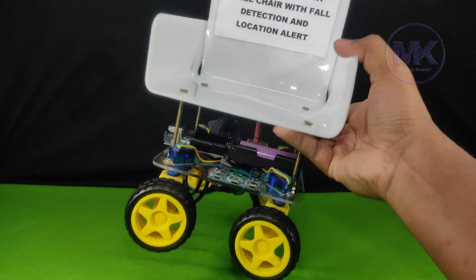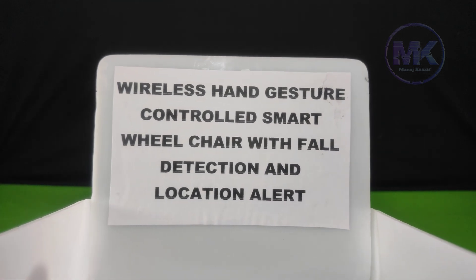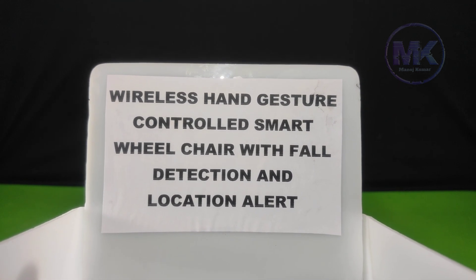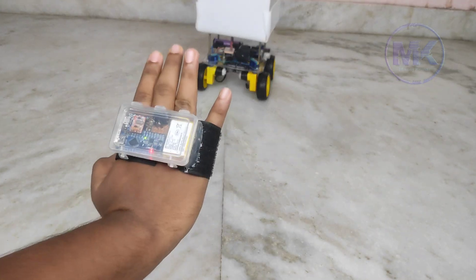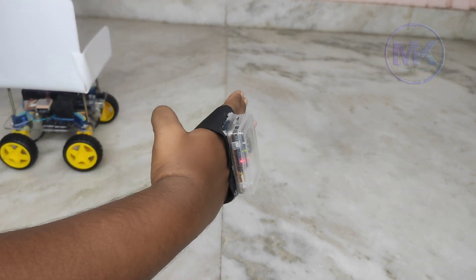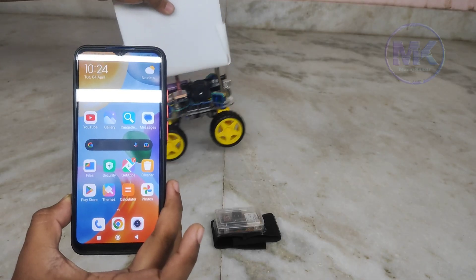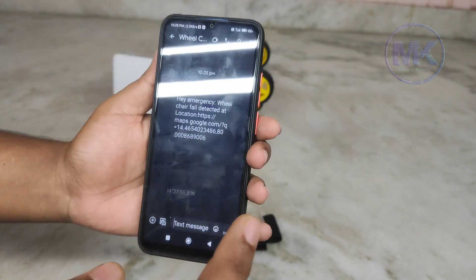In this video I am going to show my new project: a wireless hand gesture control smart wheelchair with fall detection and location alert. The main concept is to control the wheelchair using hand gestures, as well as detect falling and send the location of the wheelchair as an emergency message to family members or predefined mobile numbers.